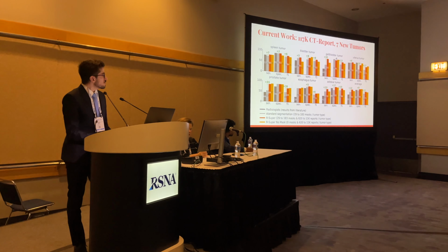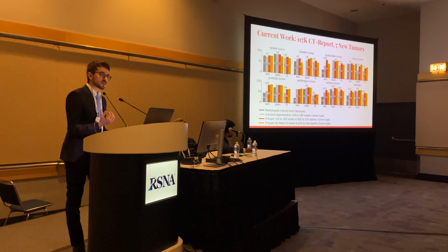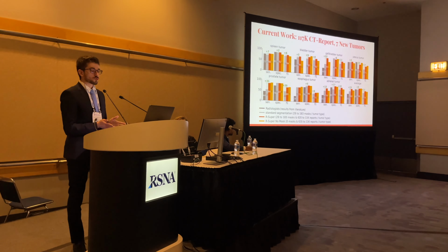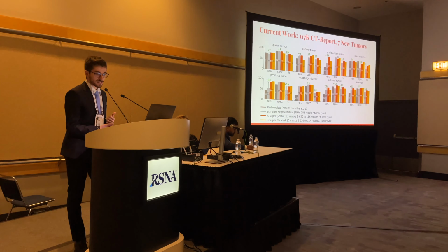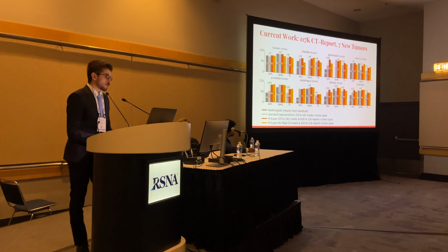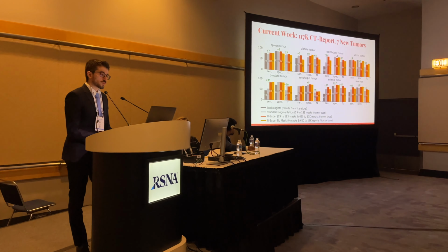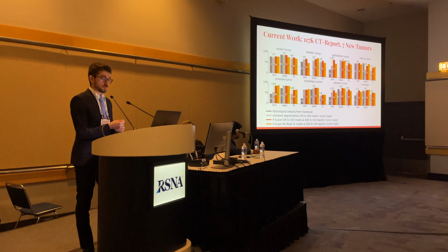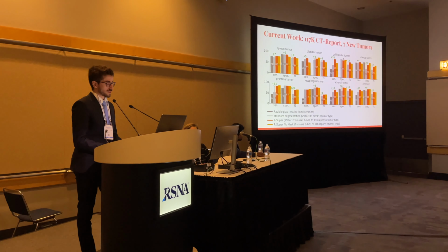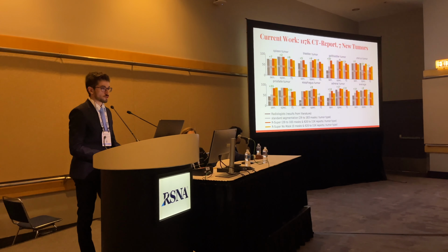But if you train only with the reports, you get the results in yellow. So training with many reports can give you better segmentation than training with few masks. And if you train with both the reports and the masks, you get the results in orange, which are the best results. And if you compare these results to radiologists' performance in the literature, for many tumor types, the AI is already superior because many of these tumors are very hard to detect in CT scans. And we plan to release the first public AI model that can segment all of these tumors.